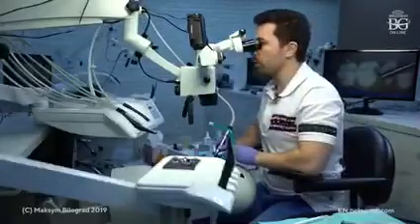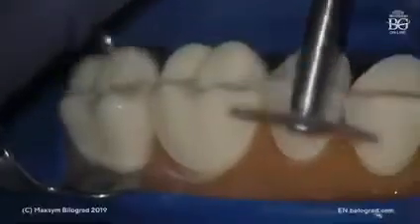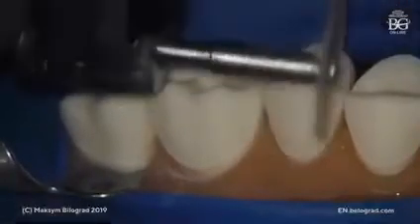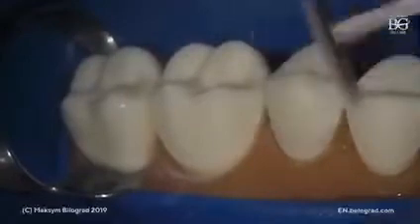Same will be with the premolar. Okay, so we move our disc gently over the surface, trying not to touch the finish line. And also, you see, with this you can make the transition from the buccal surface to the tip of the cusp that we prepped.